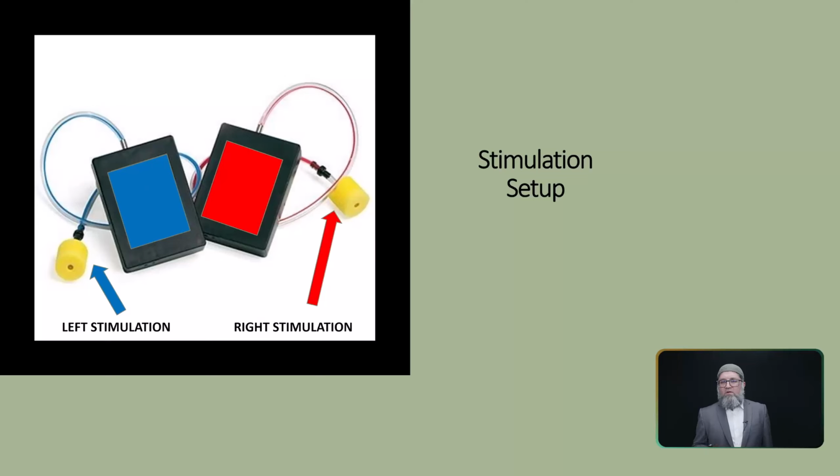So these are the small square boxes which create the sound wave, and they are known as receivers. Because they are sending the sound and we are receiving the sound, this terminology is from the phone, which used to have a receiver and a microphone. The receiver is what you hold on the ear to listen to sound, and the microphone is what we talked into.